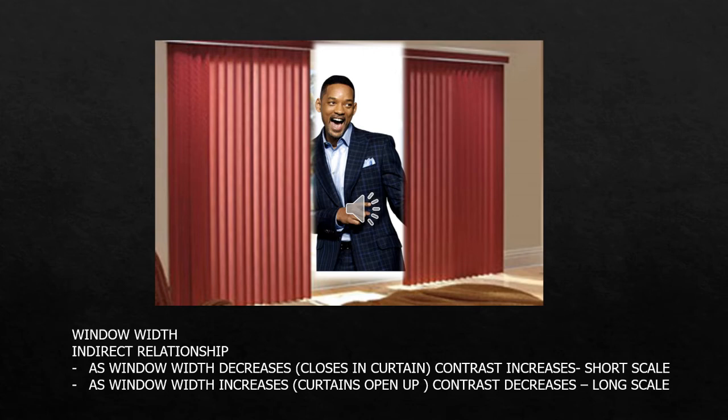This is different from window level. As window width decreases, you close in the curtain, your contrast is going to increase, creating a shorter scale image. As window width increases, your curtains open up, your contrast is going to decrease, making it more long scale.